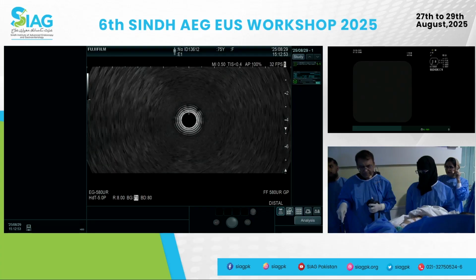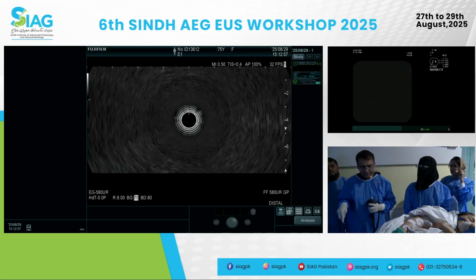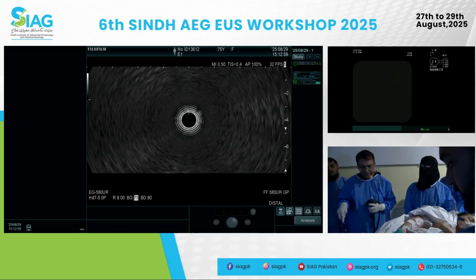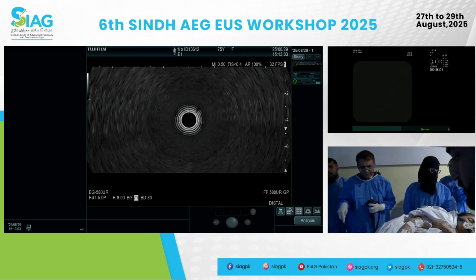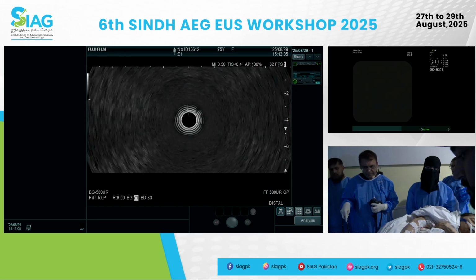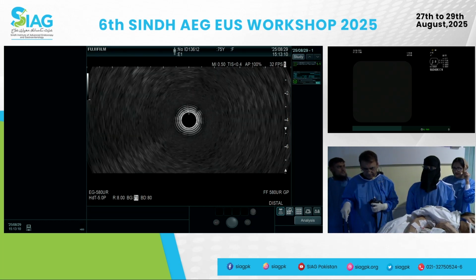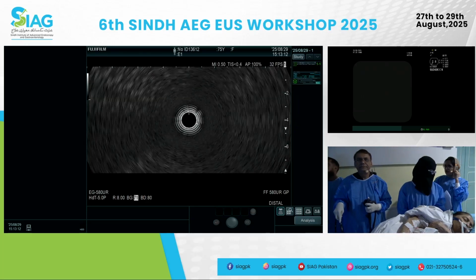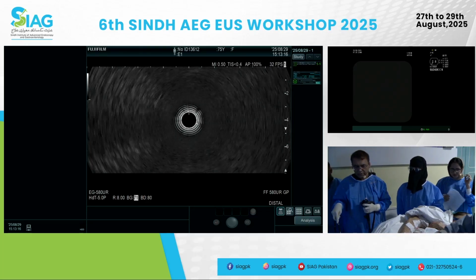15 into 10 mm. The patient's colonoscopy was suggestive of an ulcerated lesion that was starting 5 centimeter above the anal verge, extending up to 8 centimeter without any luminal narrowing. Adult colonoscope was passed without any difficulty. Her CEA level is 2.07. So we are proceeding with EUS for evaluation of that rectal lesion. Okay.